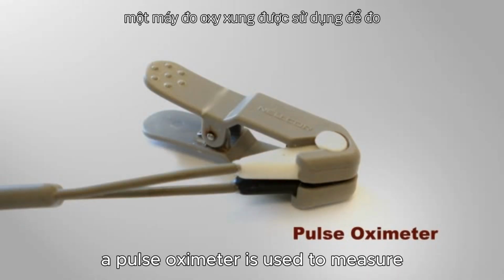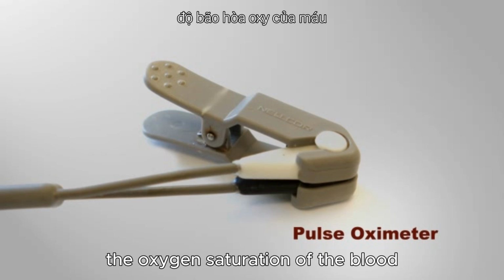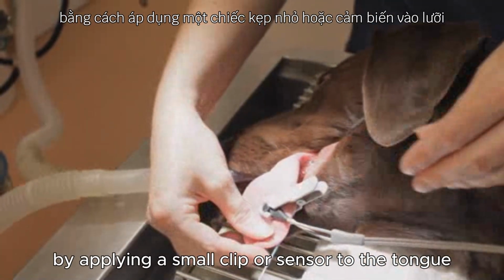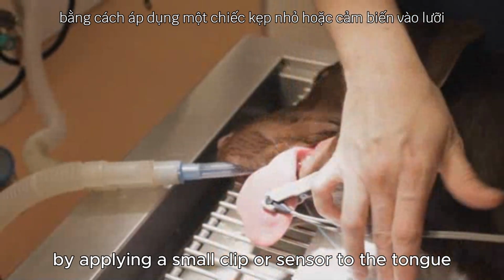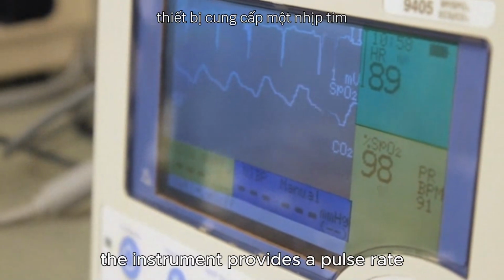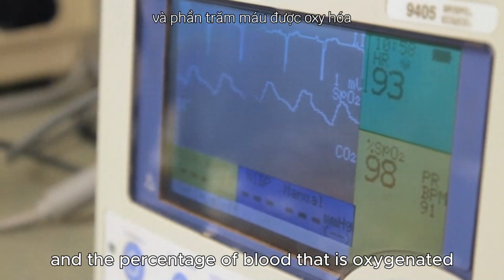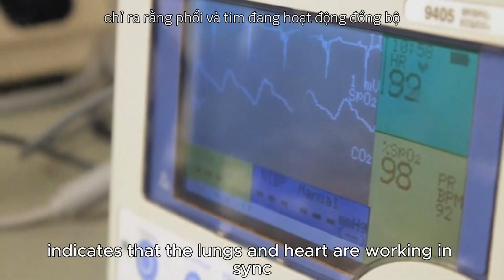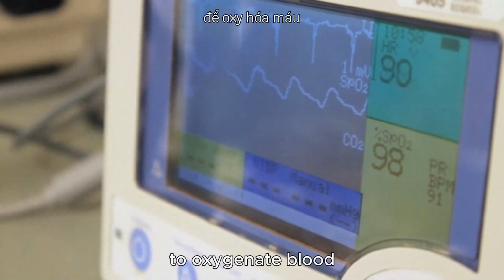A pulse oximeter is used to measure the oxygen saturation of the blood. This is done very easily by applying a small clip or sensor to the tongue, ear, skin, or rectum. The instrument provides a pulse rate and the percentage of blood that is oxygenated. A normal value indicates that the lungs and heart are working in sync to oxygenate blood.